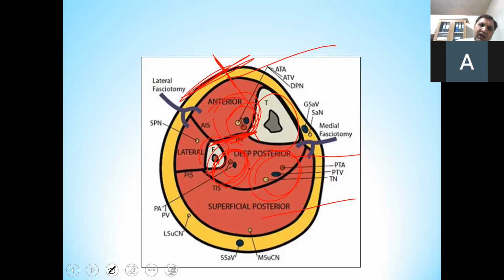But just behind the lateral malleolus, the peroneal artery and vein become a great challenge for the vascular sonologist because of its anatomic variation and small diameter.